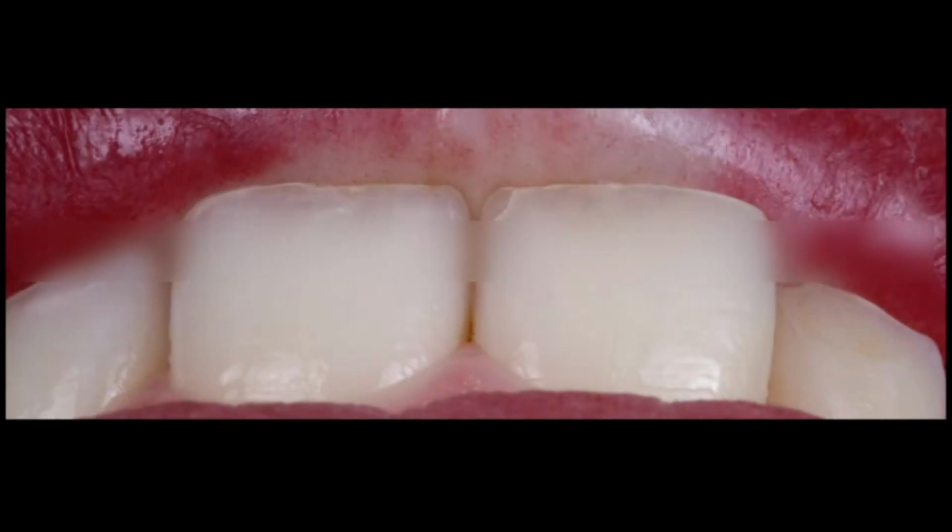And we have done that on this young lady of 17 years old. And we used composite veneers for the posteriors, occlusal veneers, and we used porcelain in the anterior aspect. We did the same with this lady. And you will complain there's a certain asymmetry in the face, but look at her. I go back again, sorry, how she looked before.